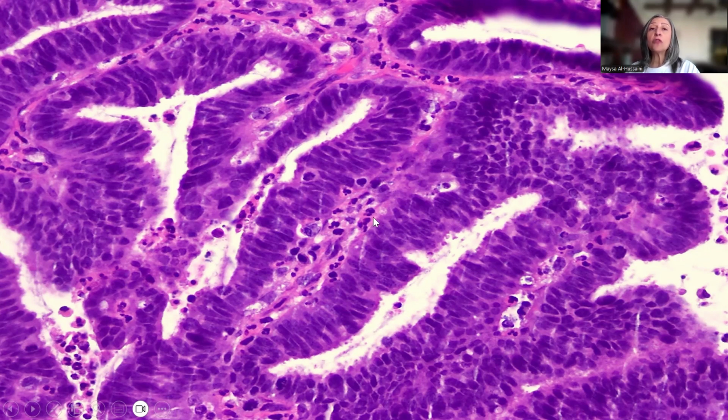Now, in order to fulfill these criteria, first of all, these have to be detected in an adenocarcinoma on low or intermediate power magnification. So both of these features have to be seen easily, mostly at intermediate power magnification, like ×10 or maximum ×20 lens.